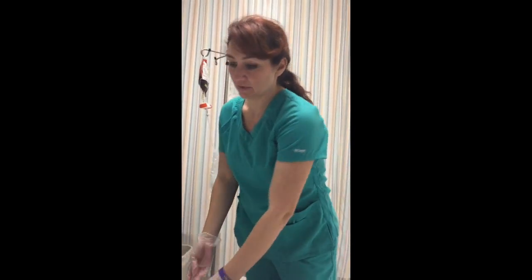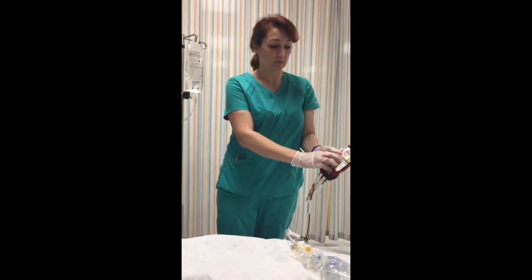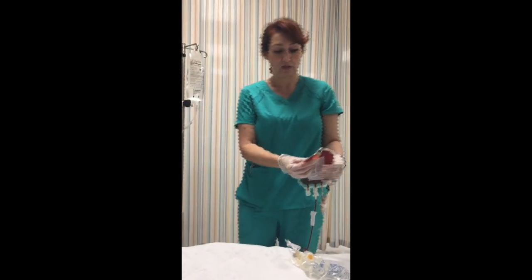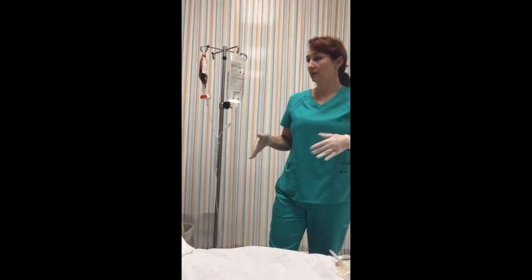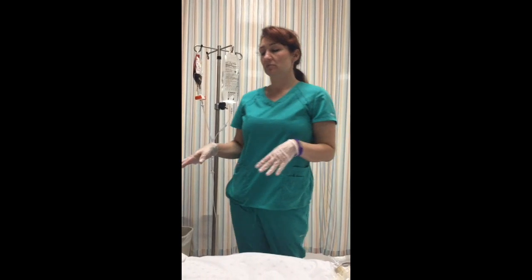Once the first bag is finished, we'll hang the second bag — but we need to go through all the same steps again. We'll get the nurse to verify the blood type (packed red blood cells), type-and-cross, expiration date, patient name spelled out, and date of birth. We'll get baseline vital signs before switching out the bags. Once we switch, we'll sit with her for 15 minutes and monitor for any reaction: flushing, trouble breathing, dyspnea, itching, or hives. If she's tolerating it well, we'll get another set of vitals and check in periodically every hour. It typically takes a maximum of four hours to infuse one unit of blood.